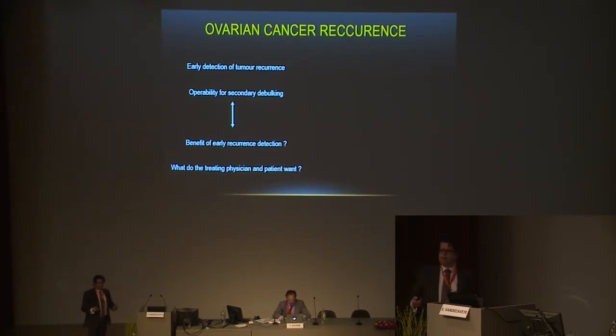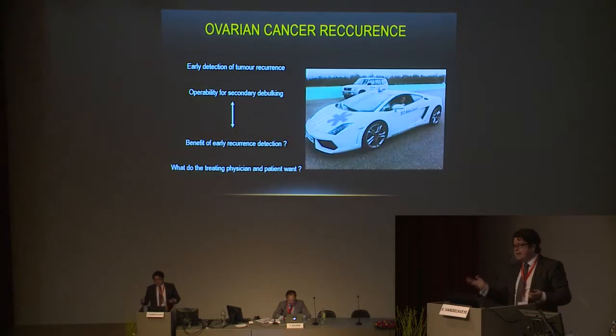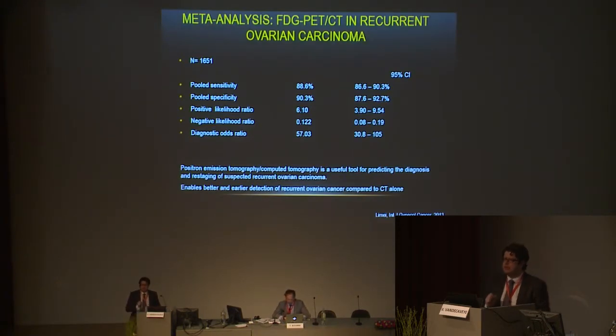And so, as a radiologist, we will never say, do a diffusion in everybody. No, we have to choose our patients very selectively for this technique, and indeed, then I get my Lamborghini out of the garage. But it's not a routine technique. It is a second line problem solver.